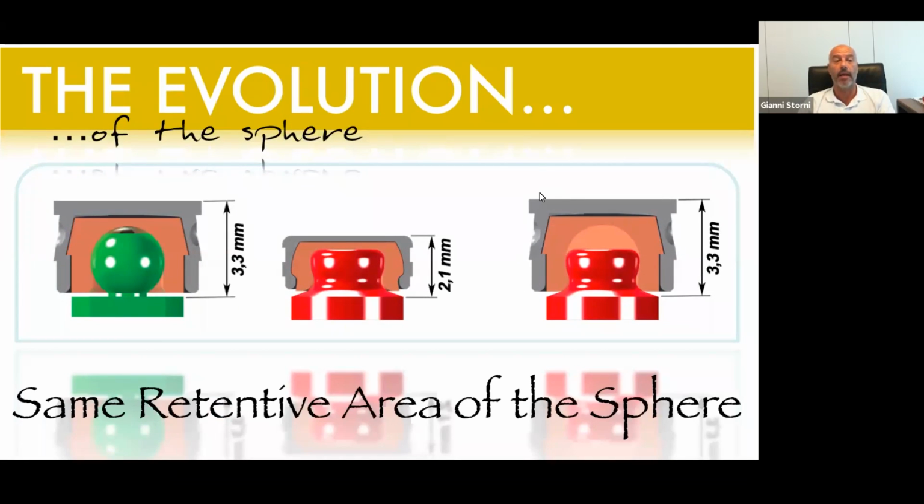Now, let's start to see what is important, what is our new solution. It's not really new now, the Equator, because it's been in the market for 6 or 7 years, but we have launched another use of this Equator for fixed solution.